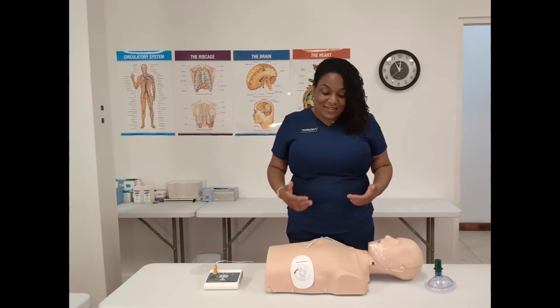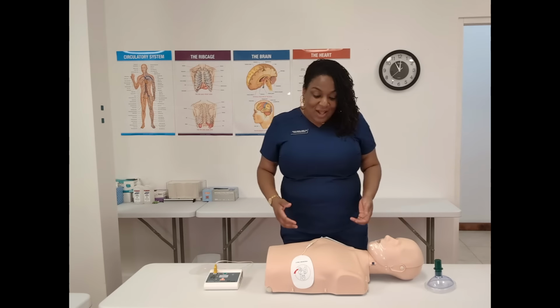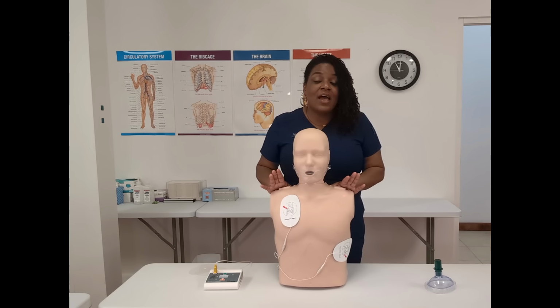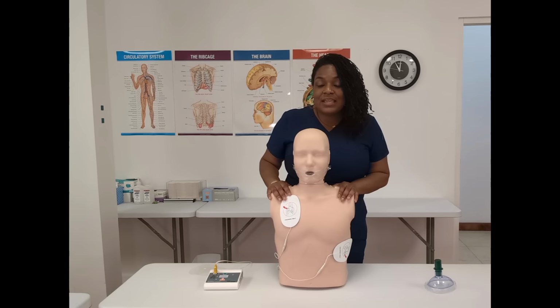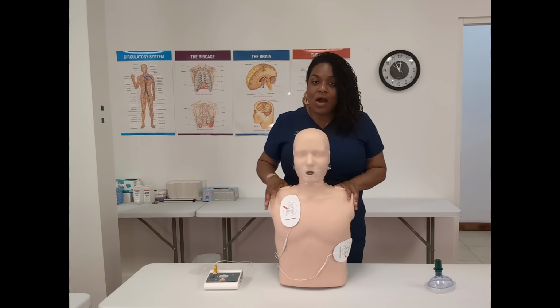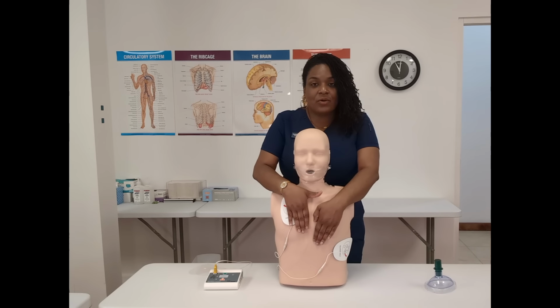Your pad placement is also the same. They do have pediatric AED pads. However, if you only have the adult pads, use the adult pads and follow the images. The only difference will be if you have a really small child, which I'll show you with our infant demonstration, you cannot allow these pads to touch. And of course, if the child is smaller, the pads are going to be closer together.